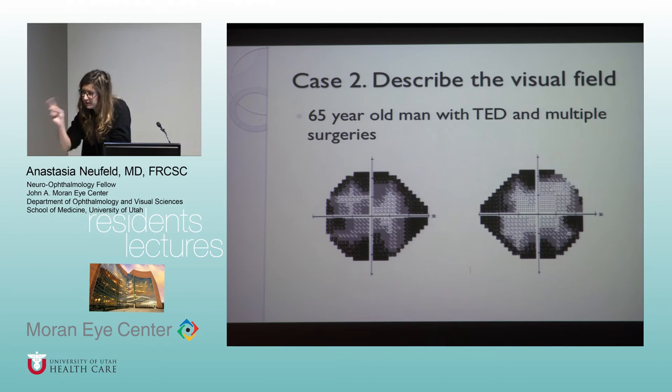Sorry, I'm going to take you back. Is it 30-2? Or maybe 30-1. Yeah, and why is that? Because you have the 30 in there, yeah, it doesn't exactly quite go. So, question for you is, what amount in degrees of visual field is a Humphrey 24-2 tested? And I'm giving a hint, horizontal and vertical. Horizontal, I guess it's 24 degrees.